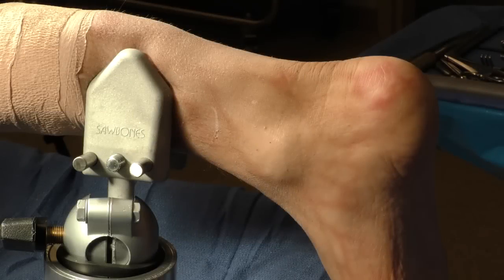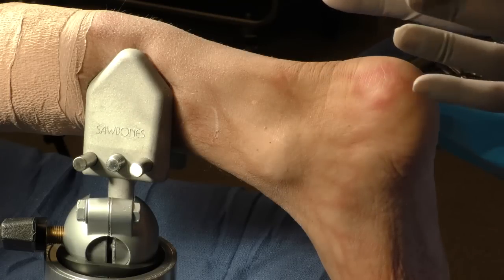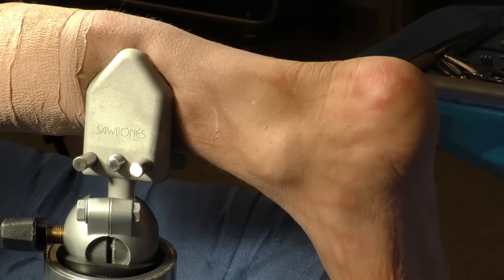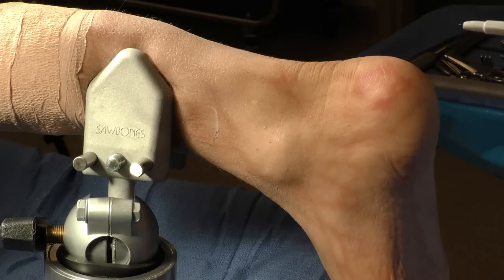Our goal today is to demonstrate the posteromedial and posterolateral approach of the ankle for posterior malleolus fractures and what we call the posterior pylon variant, to exemplify what the plates can do, how they fit, and how they can help you perform these cases much more easily than a standard one-third tubular or one-quarter tubular set. They have been designed anatomically and can be used for multiple approaches. In this segment, we'll demonstrate the prone approach with both a posteromedial and posterolateral technique to place both plates.